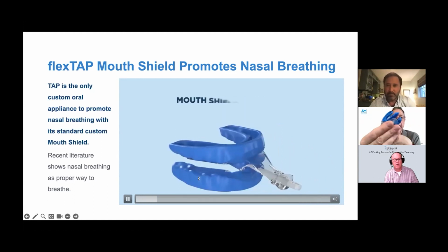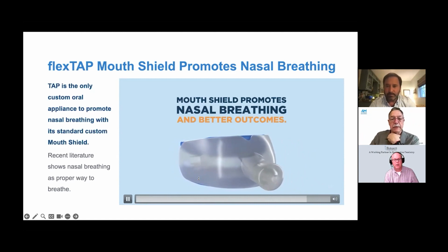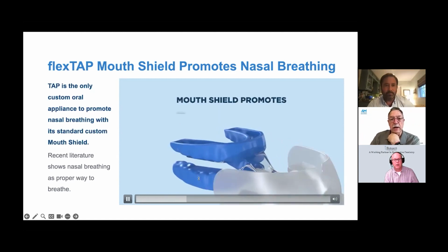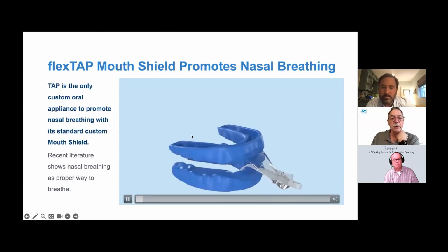I do run mine under warm water before I put it in my mouth. It makes it a little easier to tuck over the teeth, but you don't have to do that. That makes them a little more comfortable. But that's how I put mine in. But I guess you can put it any way you want.